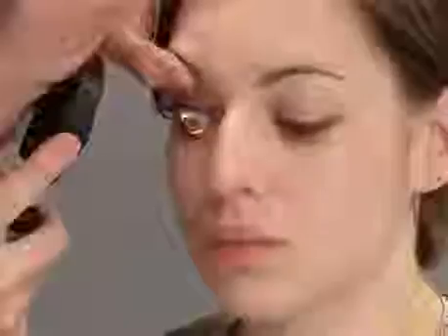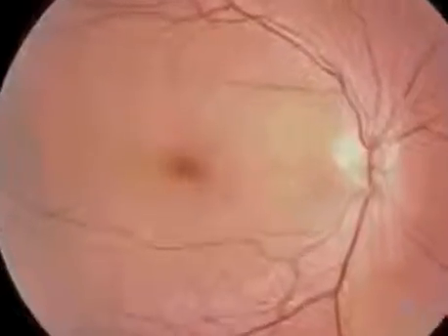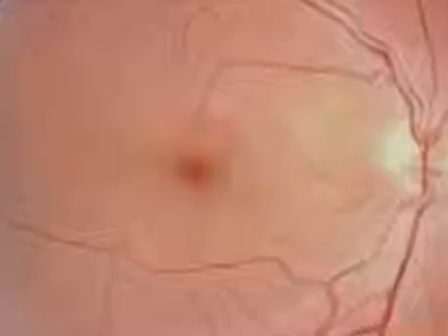In order to examine both the lower quadrants, the lid has to be lifted up as the patient looks down. As the final part of fundoscopy, you should examine the central retina lying inside the vascular arcades. It contains the macular region and the centrally located fovea. To bring the fovea into view, simply ask the patient to look directly at your light. Some patients will find this difficult to tolerate, which is why it is best left until last. You have now completed your examination.